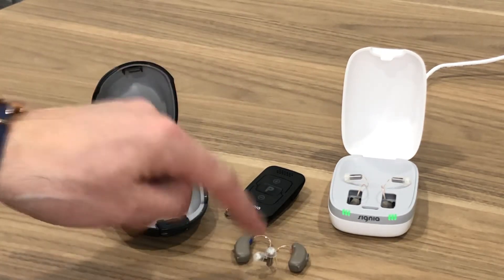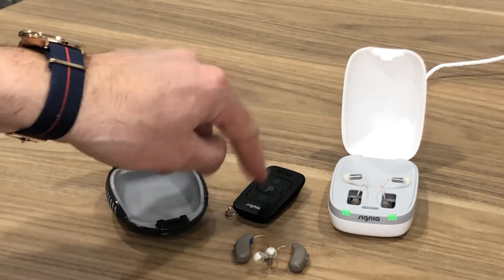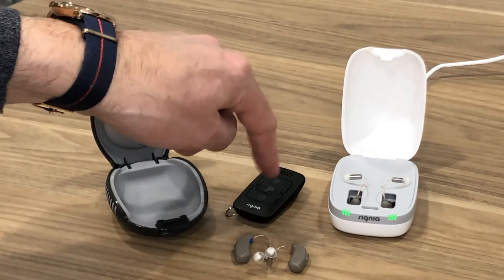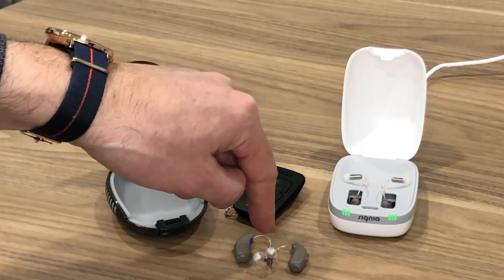To double check, put the hearing aids in your ears so you can hear what's going on. As you press some of the buttons, you should hear indicating tones come through the hearing aids letting you know that pressing buttons is making changes to the hearing aid.